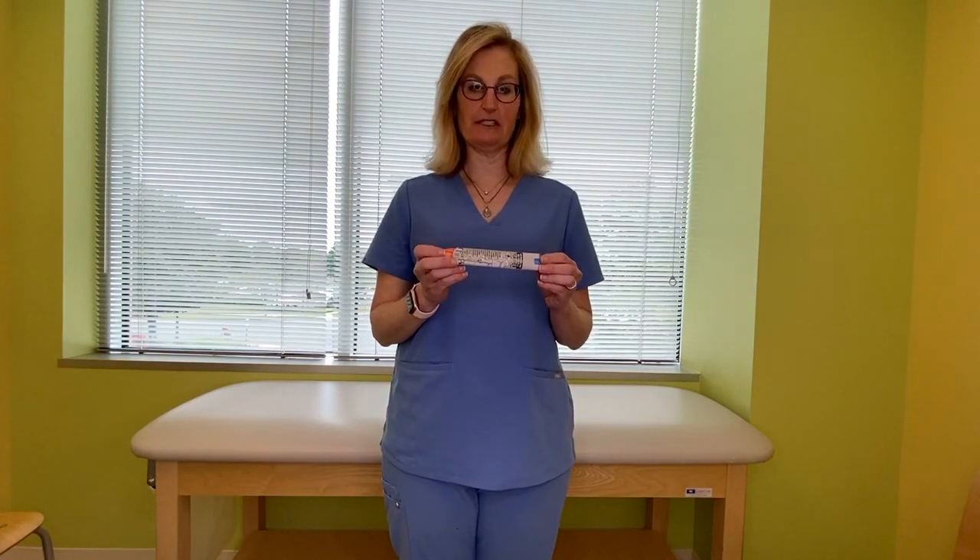Hi, I'm Dr. Rachel Schreiber, and today we are going to go over how to use injectable epinephrine. This is called an auto-injector. That means you don't have to draw anything up, you don't have to press anything. When you press it with enough pressure, the medicine will come out.